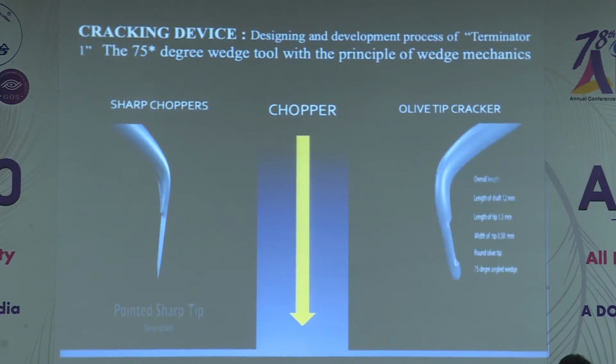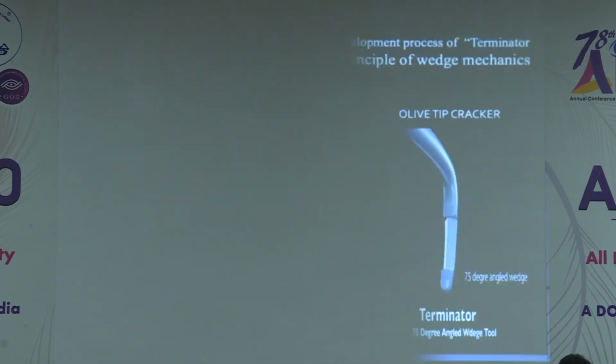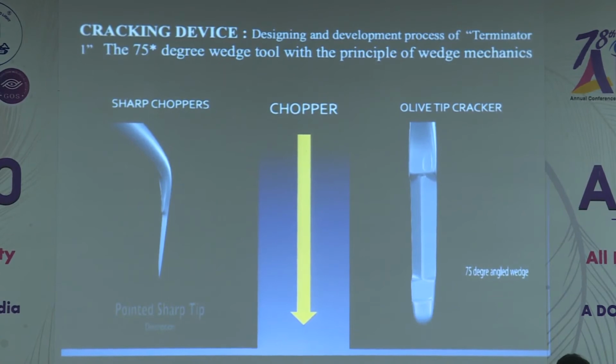It doesn't have a sharp tip. It works like a cracker. It works like the chisel. And so you can see the design here. So this is the inner edge. The inner edge is a wedge, and the tip of the chopper is round. It's a round olive tip. So why is it made a round olive tip?